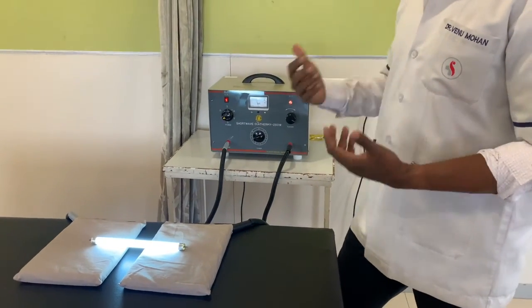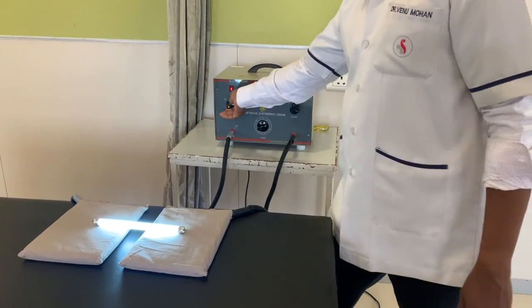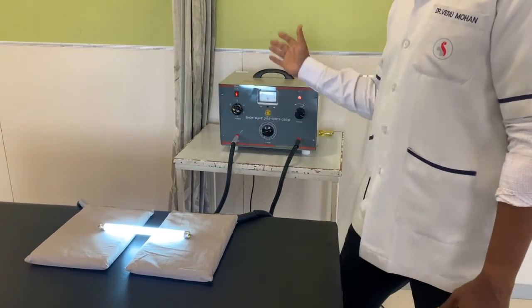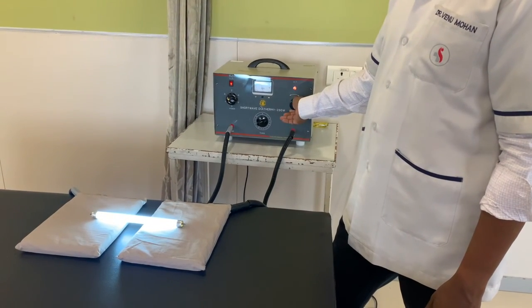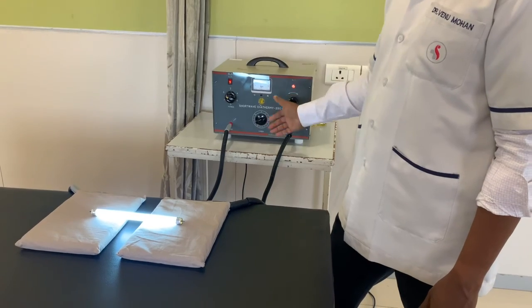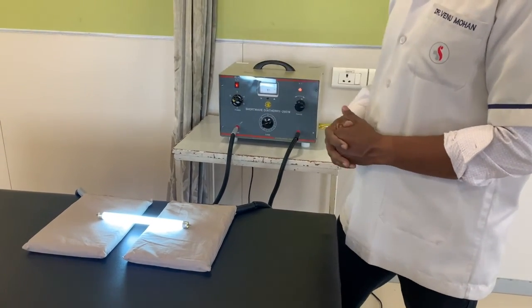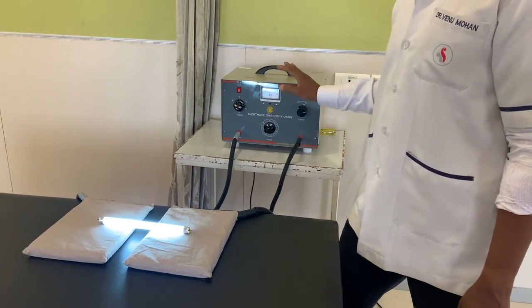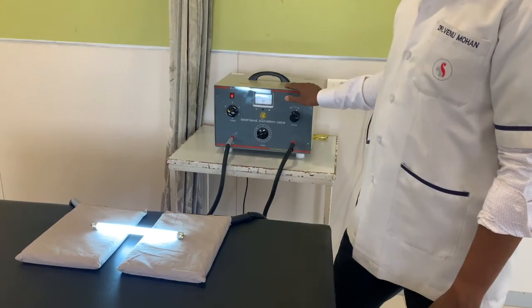Suppose the patient feels that the warmth is very less, then you can increase the intensity. Whenever you increase the intensity, again you have to go check the tuning. Again you have to find the point where the intensity is maximum. Every time you increase or decrease the level of the power, again you have to tune it and see that there is maximum output of the machine.